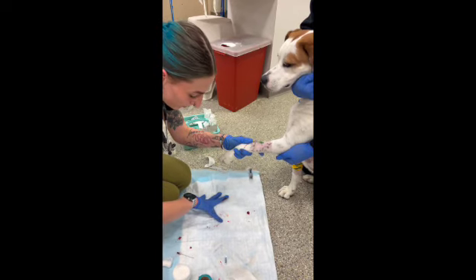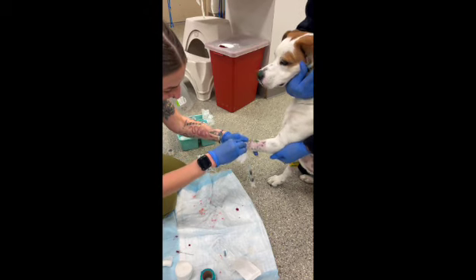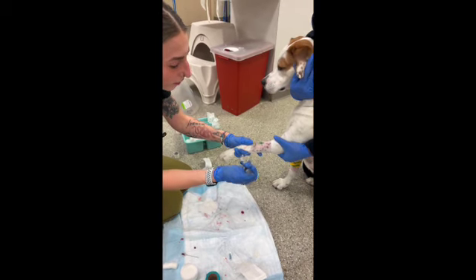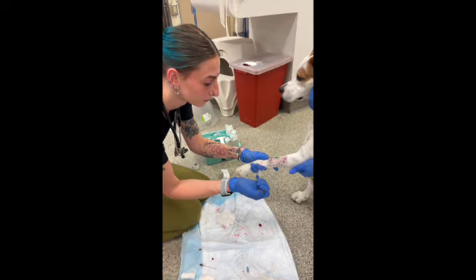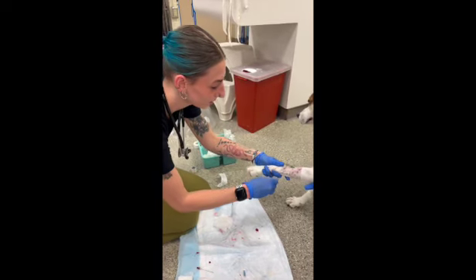I'm going to try and wipe off my hand as much as I can because it's covered in blood. Then we're just going to give it a good flush and have our holder palpate it just to make sure that we know it's in the vessel. All right, so it's flushing well, and she said that she could feel it in the vessel. It's okay, sweet girl. You're okay.